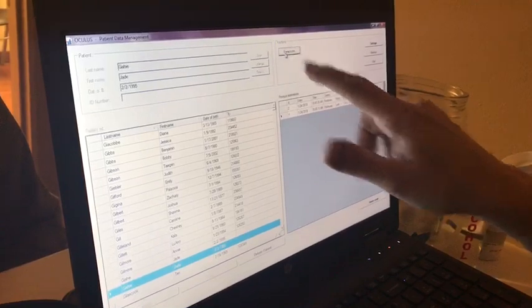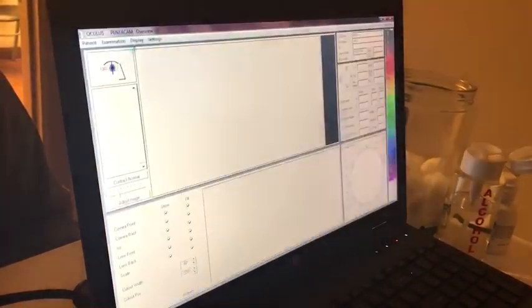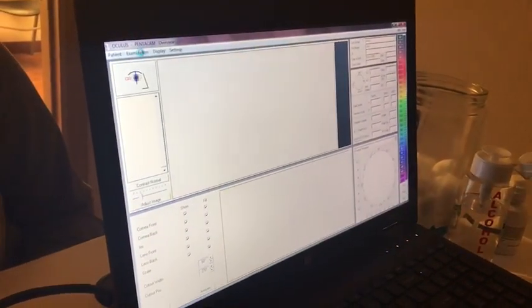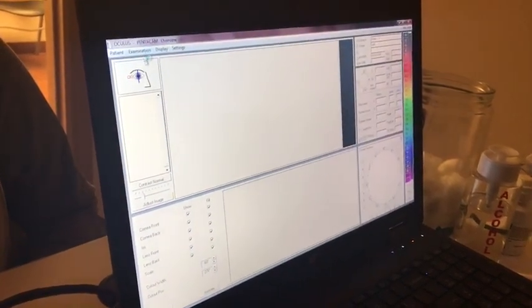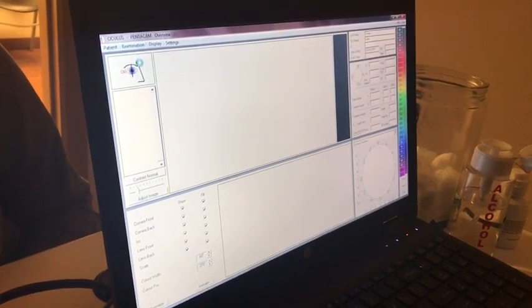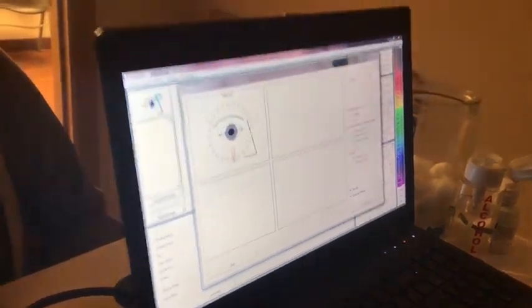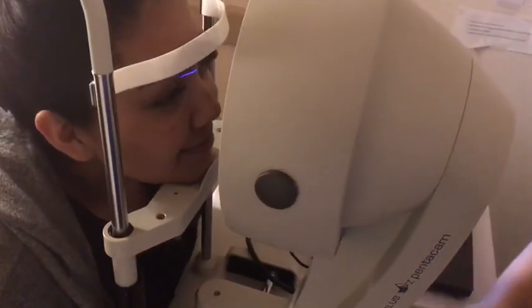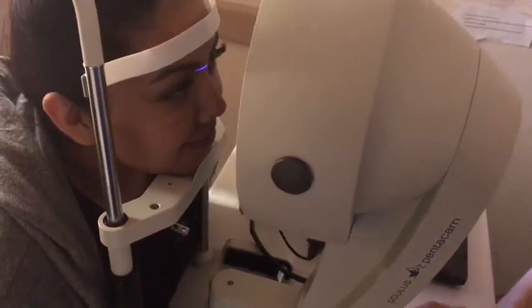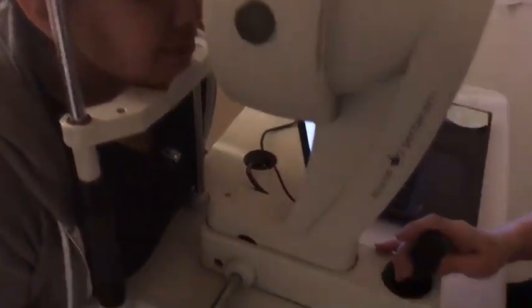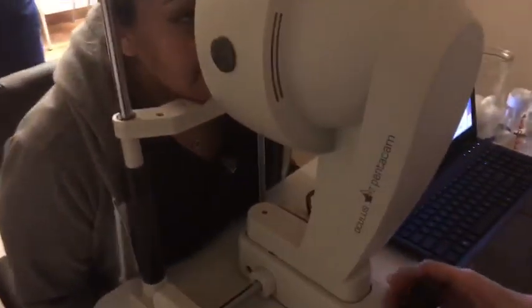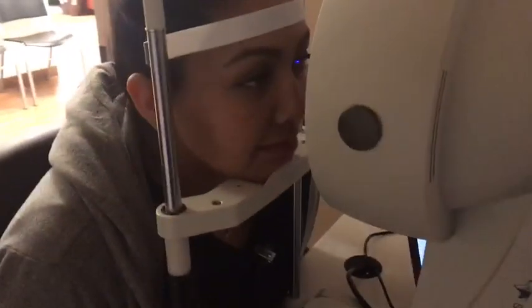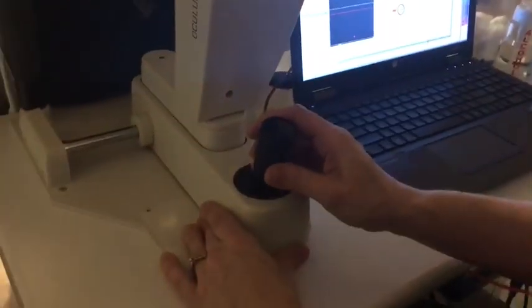We're going to hit PentaCam. We're going to go to examination and scan. And now we're going to have our patient put her chin right here and push her forehead all the way forward until it touches the bar. And then I'm going to have you stare straight ahead at the blue rectangle. There's a black dot in the center of it and just look right at that black dot.